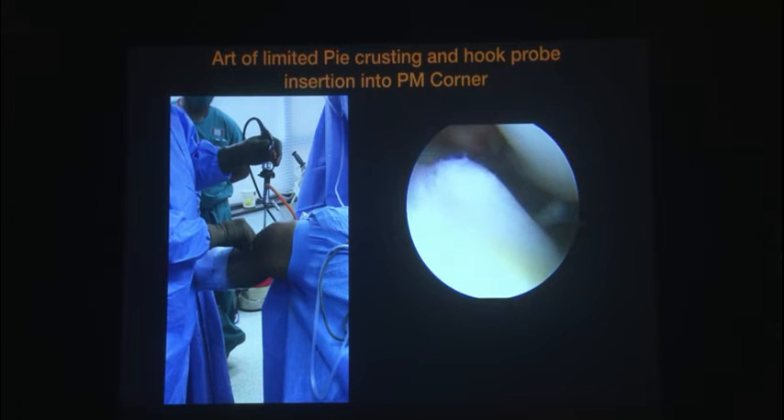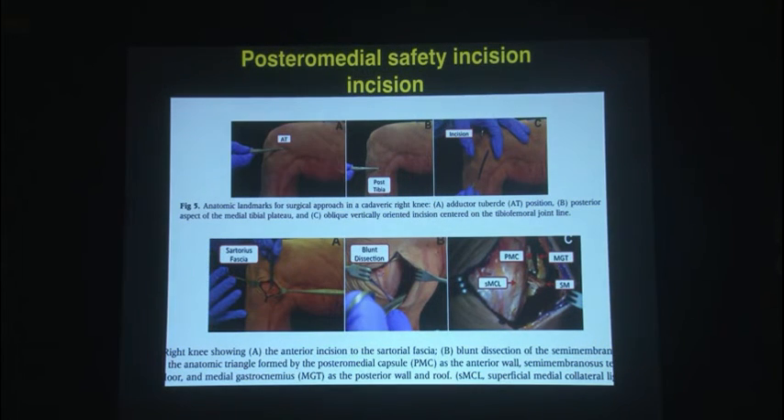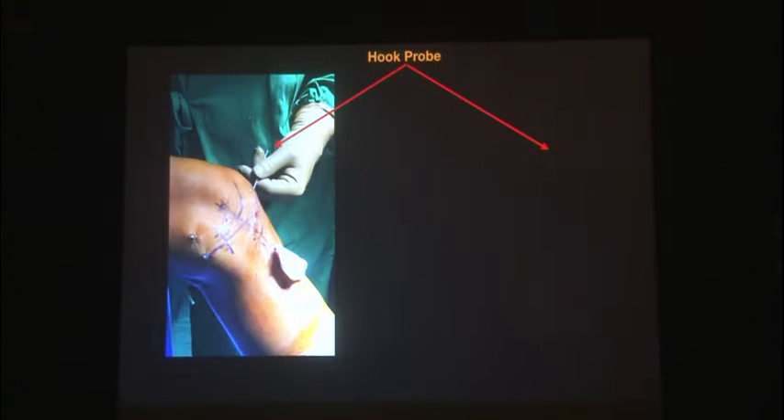The next thing is the hook probe technique that I learned from Robert Leprath. I shift the scope to the medial portal, get my hook probe from the lateral portal, and shove it into the posteromedial corner — that can be palpated there for you to create a safety incision. If you want to do inside-out meniscus repair properly, you need to know how to take a good safety incision. You feel for that hook probe, go posterior to the medial femoral condyle, and take a vertical incision. The first thing you come across is the sartorius fascia — do some blunt dissection. In the front is your superficial MCL, in the back is your medial gastrocnemius, and below is your semimembranosus. Put a retractor down in the semimembranosus, a retractor in the superficial MCL, and a spoon pushing the medial gastroc away. That's the hook probe technique for the safety incision.